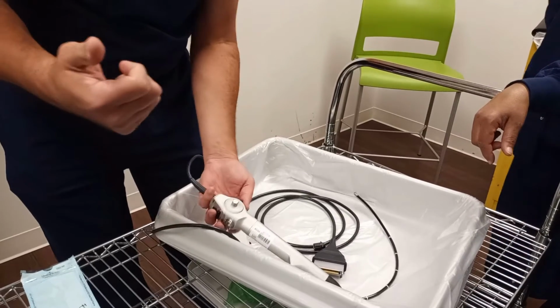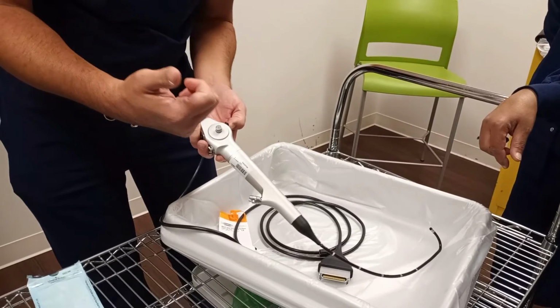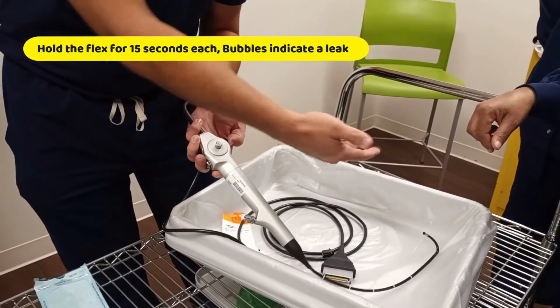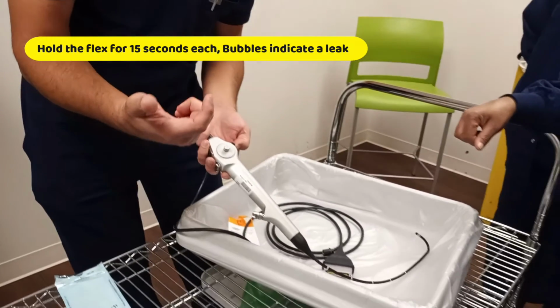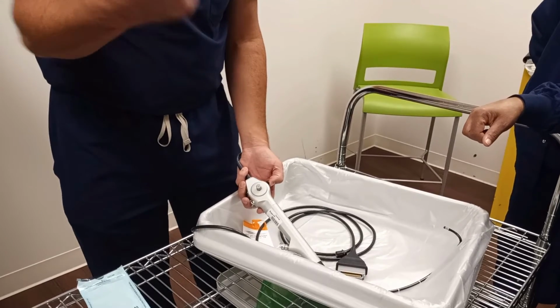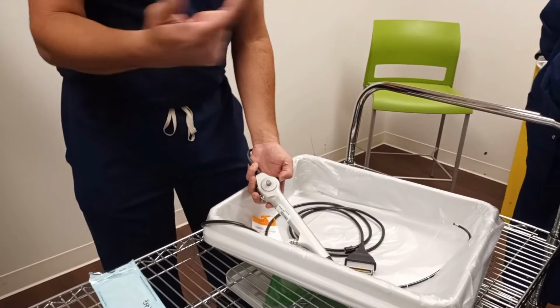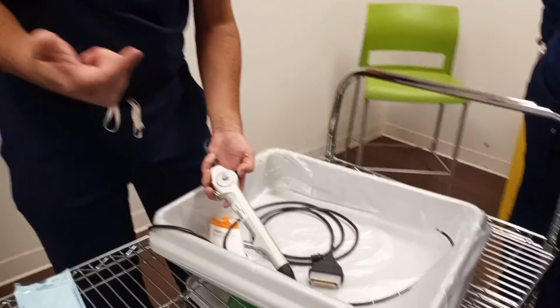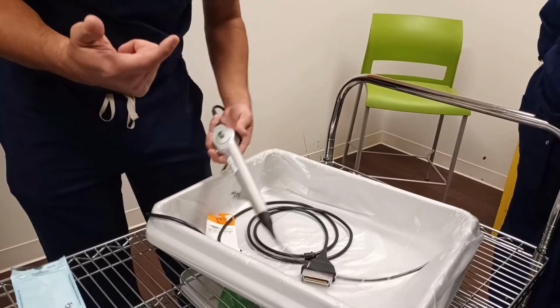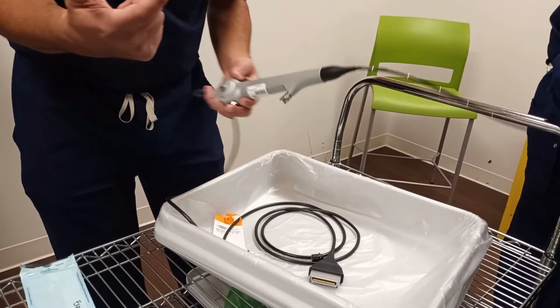Then you're going to take your other hand, while watching the leak tester, and you're going to deflect the scope and hold it in each direction for 15 seconds. So you're going to hold it in this formation, the up formation, for 15 seconds. What you're looking for is bubbles, anything that might have gotten by with the dry leak test. If you see bubbles, it's an indication of a leak in the scope somewhere. So it's a failed leak test. You're going to hold it 15 seconds in the up formation, 15 seconds in the straight formation, 15 seconds in the down formation, and 15 seconds back in the straight formation, for a total of a minute.